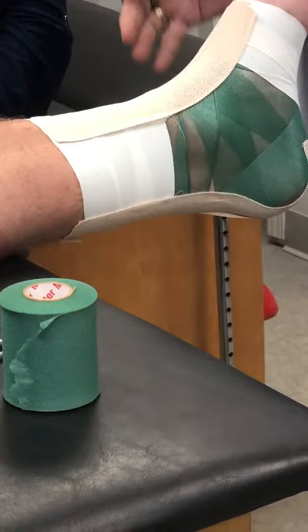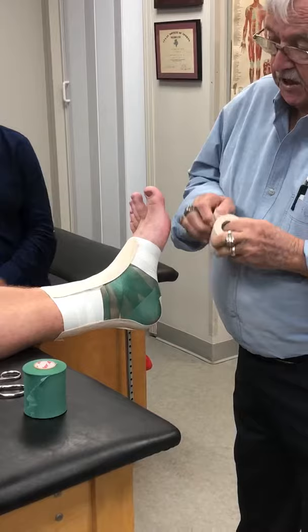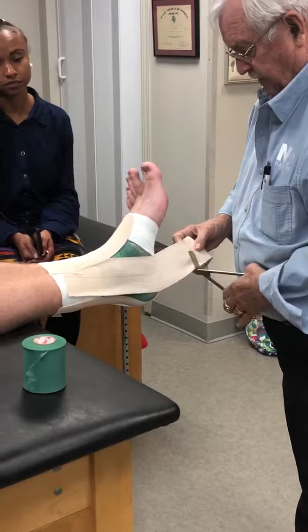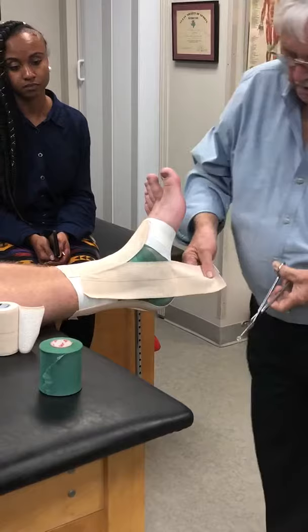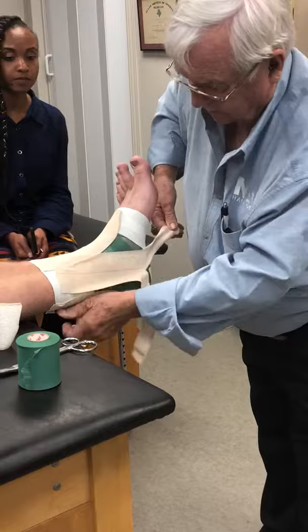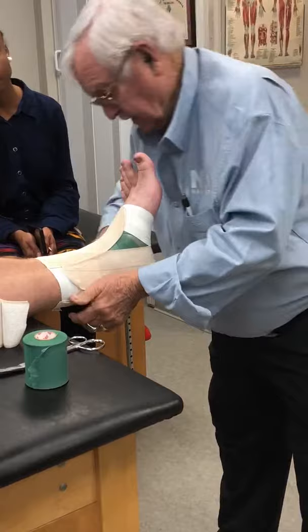Now we've got the ankle pretty well in position. Step on it — it's not going to go forward, this is going to stop it. With this one, the next four strips are the same way. Bring it forward, bring it around.